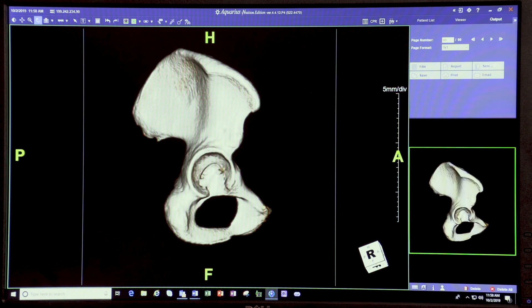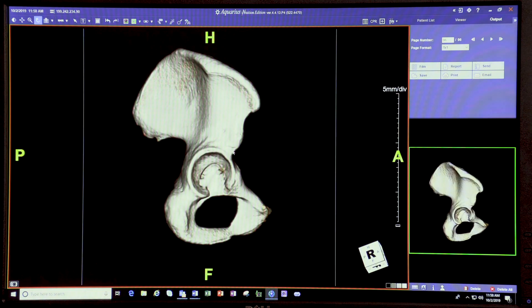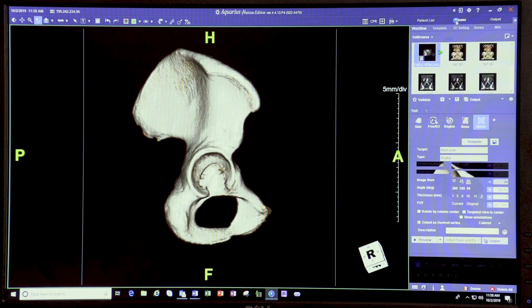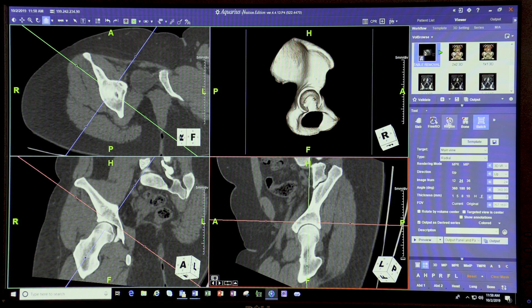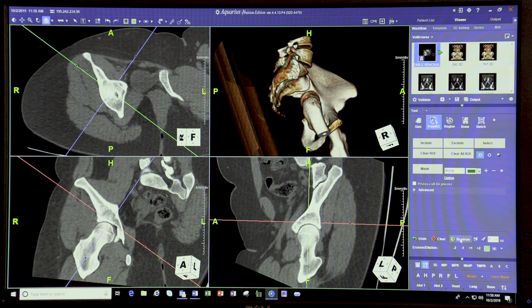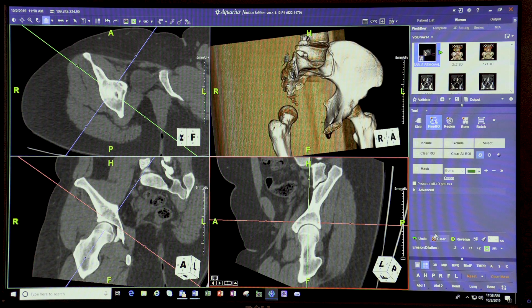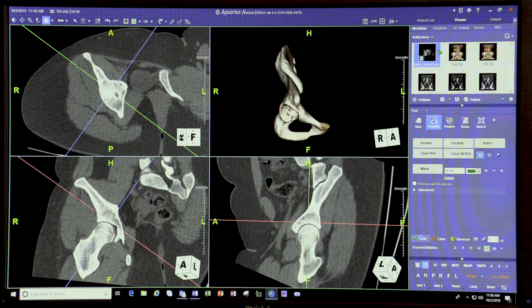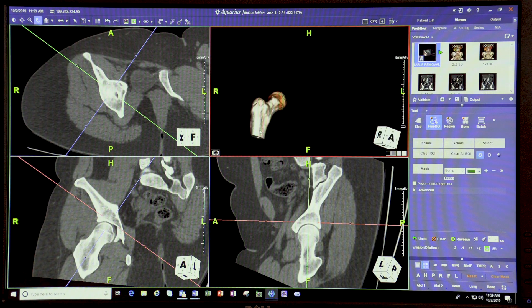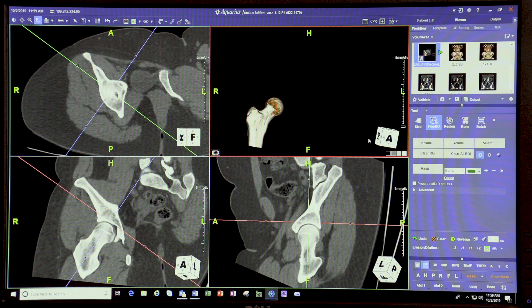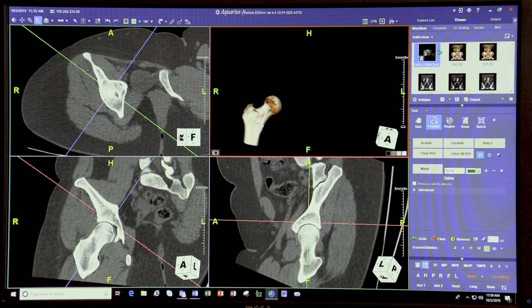You can always go back to where you started: go back to Region of Interest, do Reverse to get the remaining pelvis, then do Reset, Undo, and Undo to return to different states as needed. You can always do that. One would repeat the same process for the left side — whichever side is being operated on — so you can show individual segmentations of both hips.